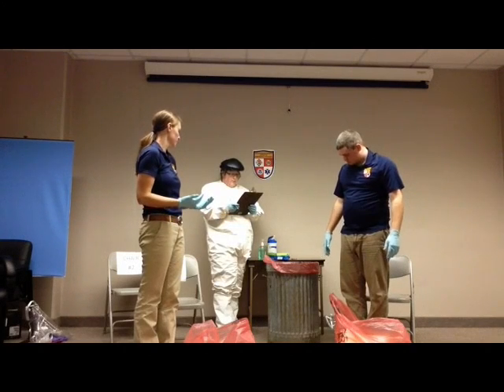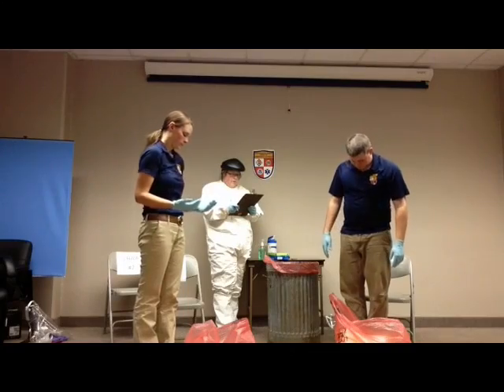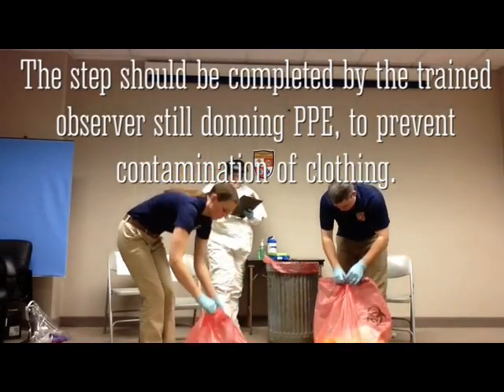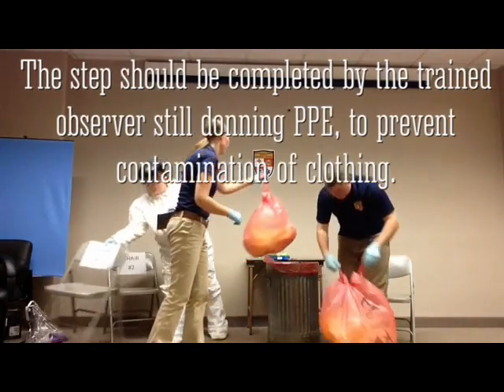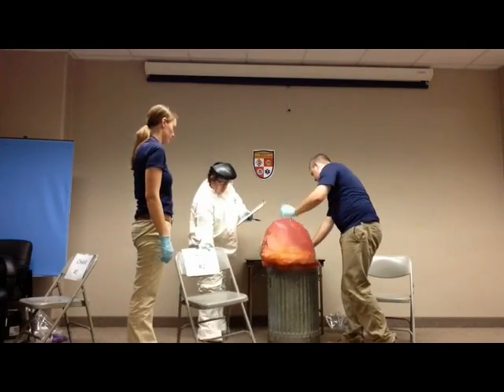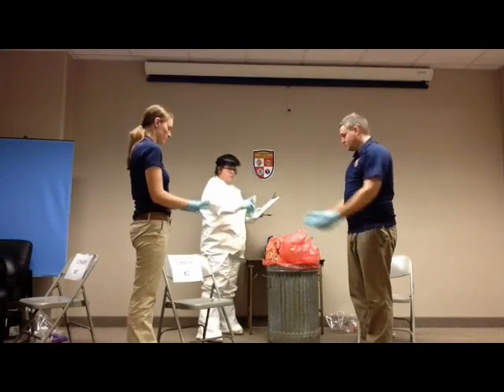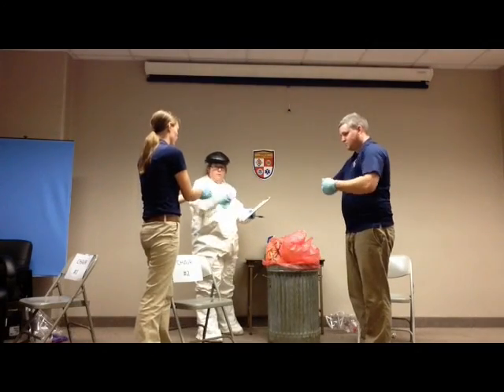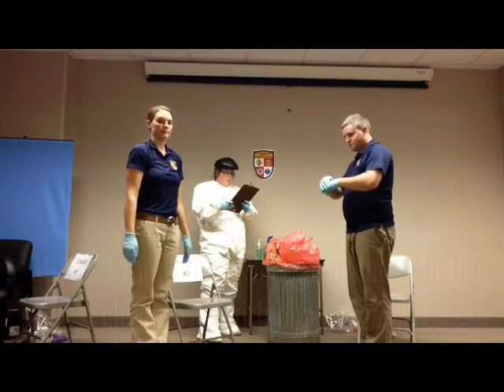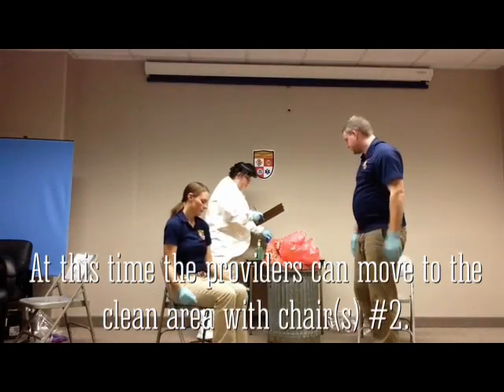Ensure all PPE is either in red bag with coverall or garbage can with red bag. Tie bag with coverall and place into garbage can. Inspect and disinfect gloves. Sit in chair number 2 and disinfect shoes, bottoms and sides, with registered disinfectant.